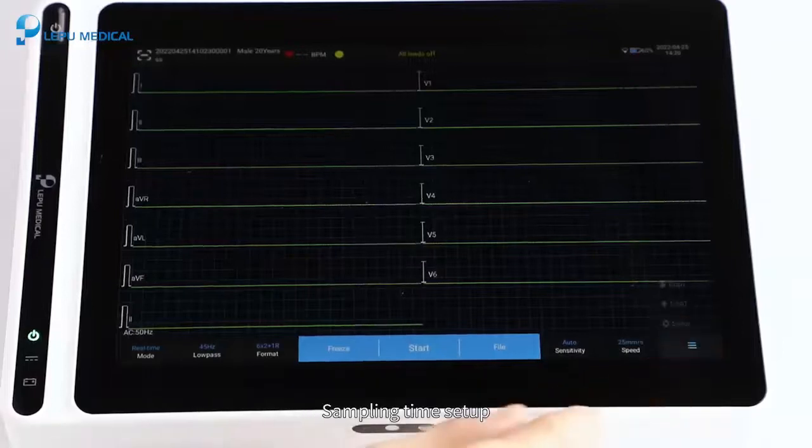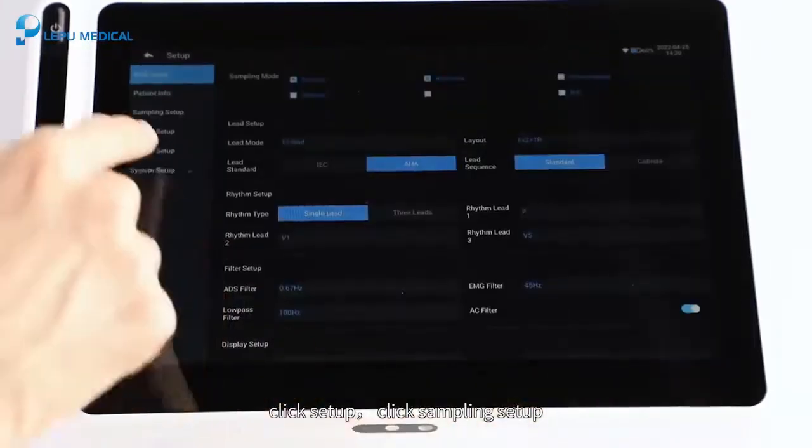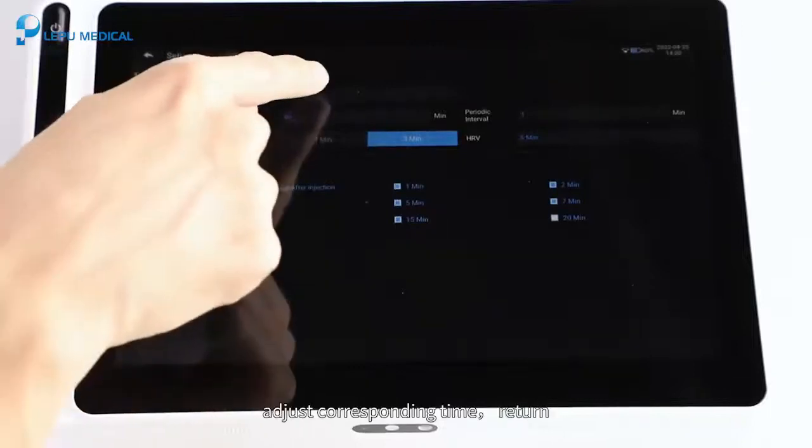Sampling Time Setup. Click Setup. Click Sampling Setup. Adjust the corresponding time.